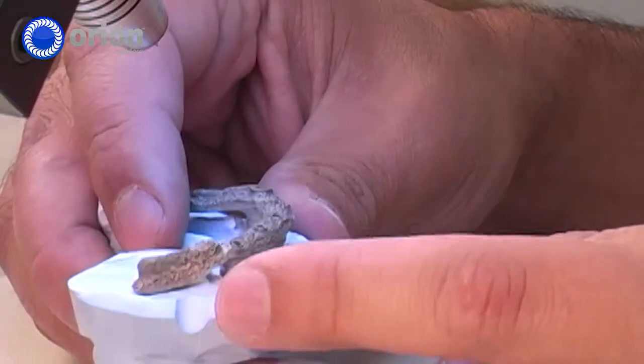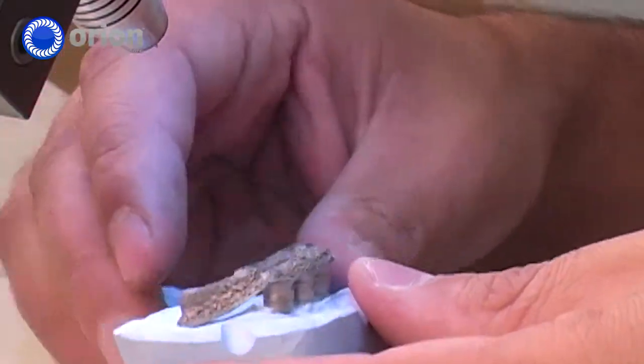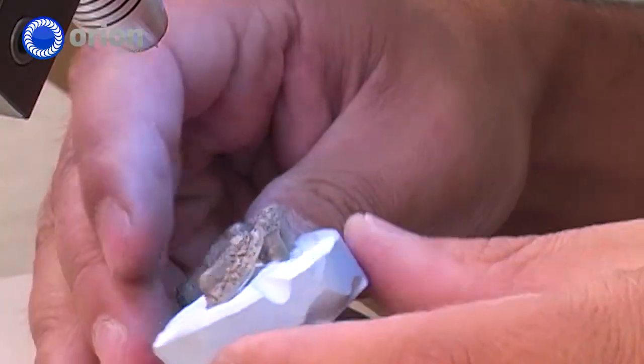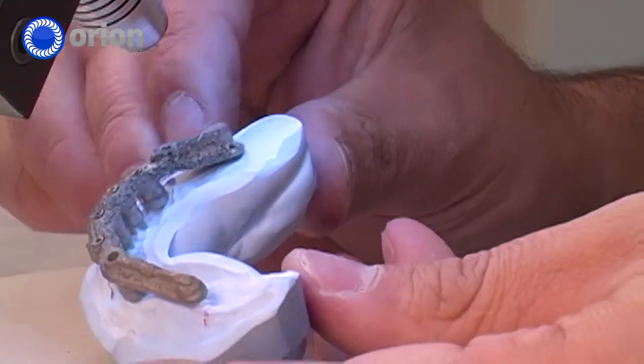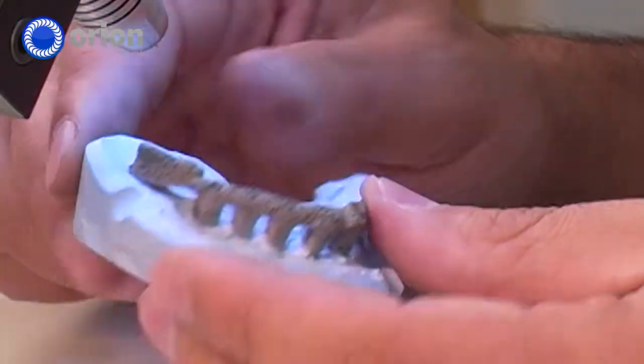We just added a piece here to heighten our implant bar, and you can see the weld going all the way around. We just cleaned it up.